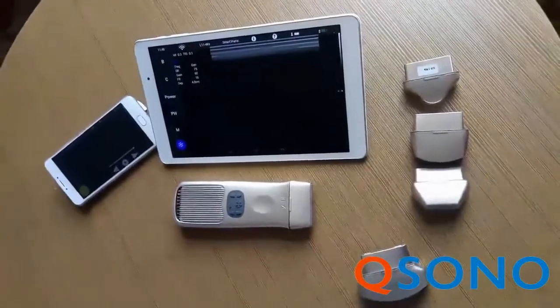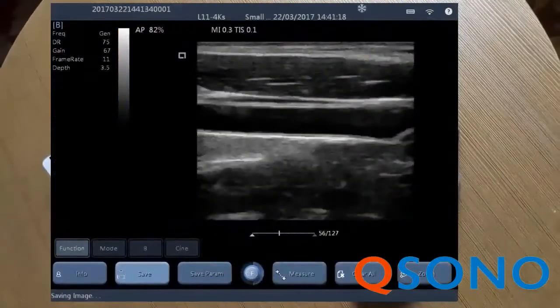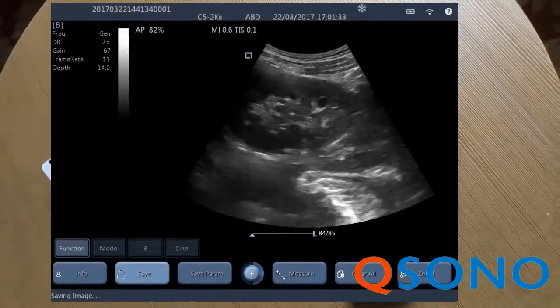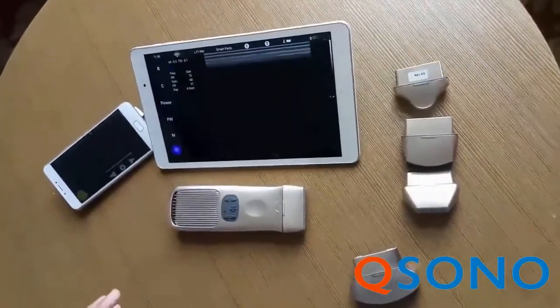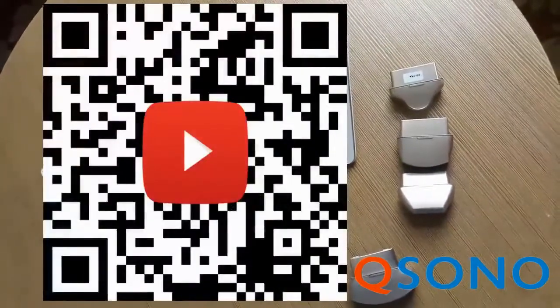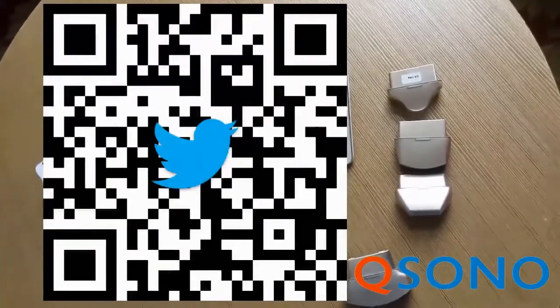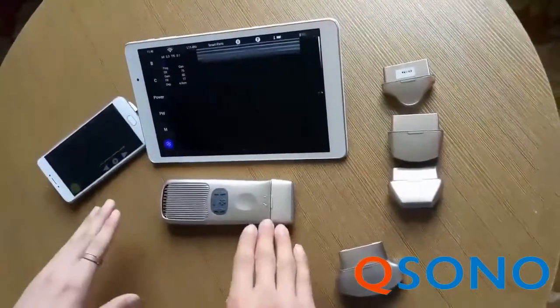And clinical images. For more information, please scan the QR code below. Put a wireless pocket ultrasound system in your pocket.